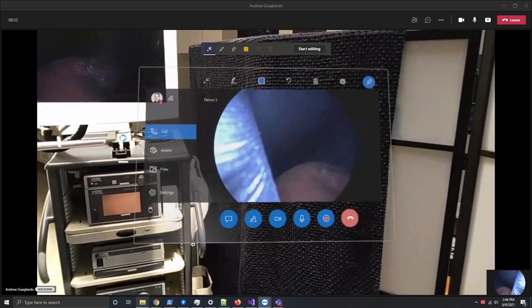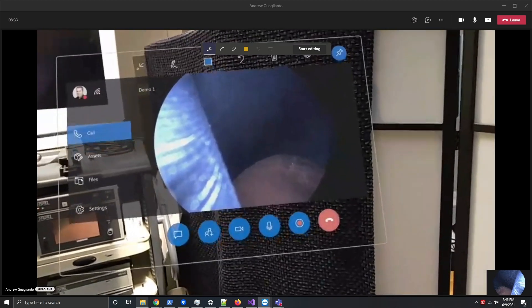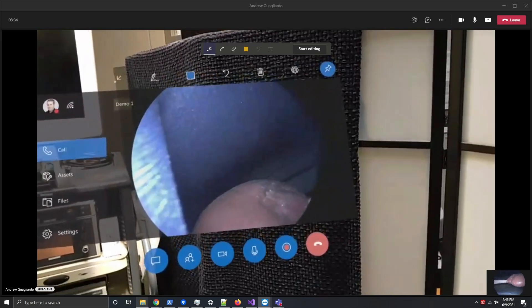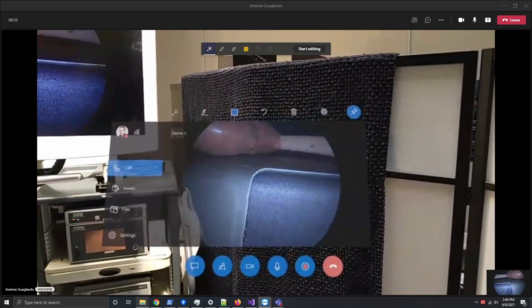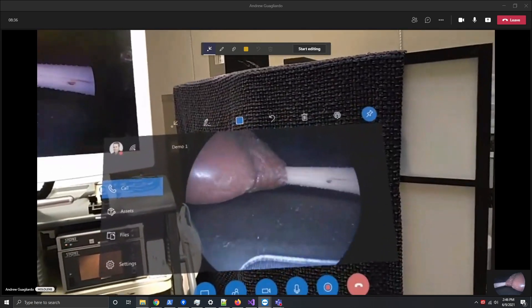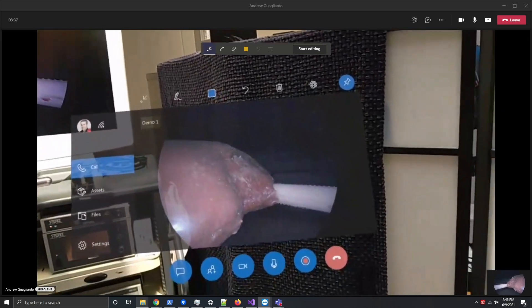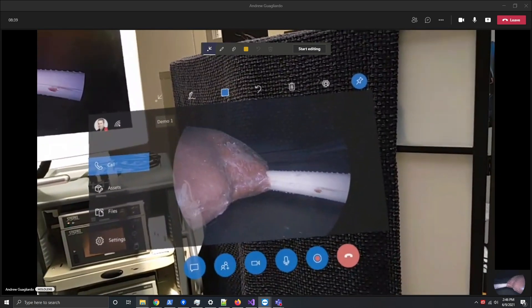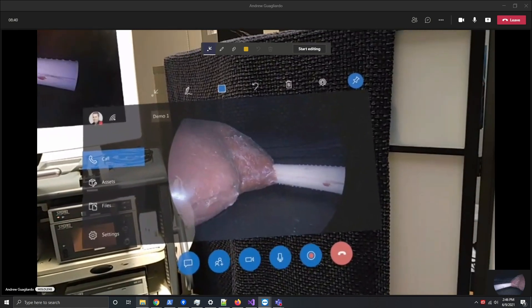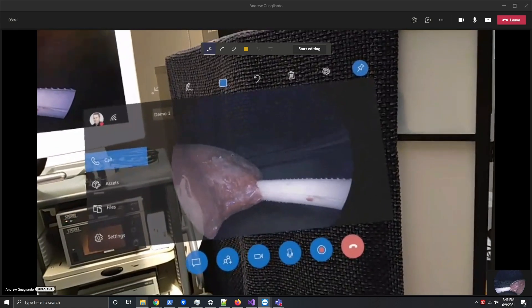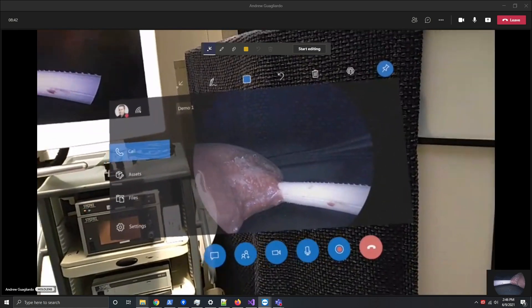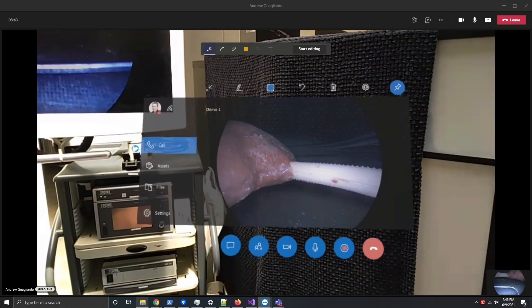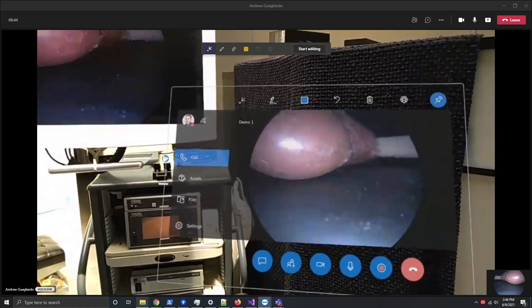And now I'll go ahead and grab my scope. You'll notice I get the same level of depth of field, the same clarity, the same lighting, the same resolution as I had previously.